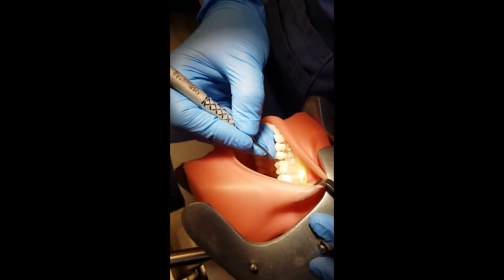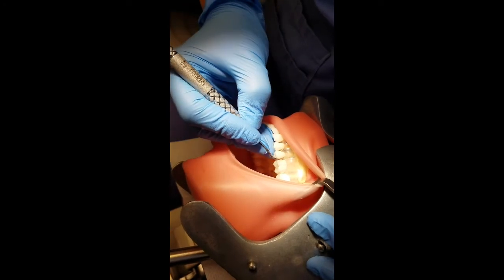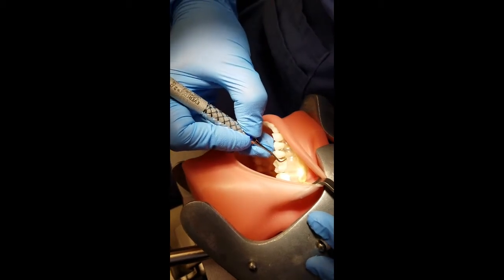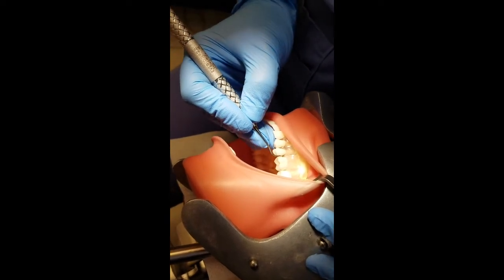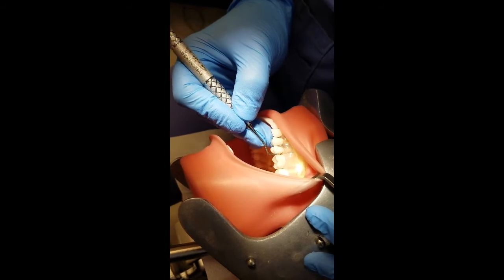Make sure to roll the instrument to maintain adaptation at the line angle. You may have to pivot on your fulcrum to maintain this adaptation. Continue the vertical strokes until the tip of the instrument is under the contact area. Once at the contact area, you're going to back out with the tip being the last thing to exit.